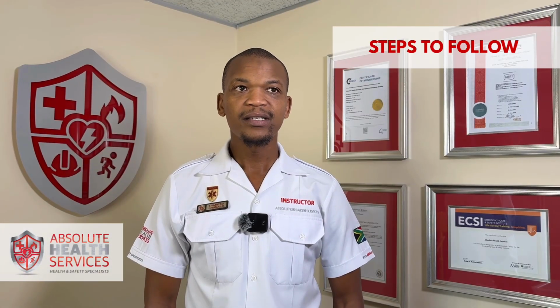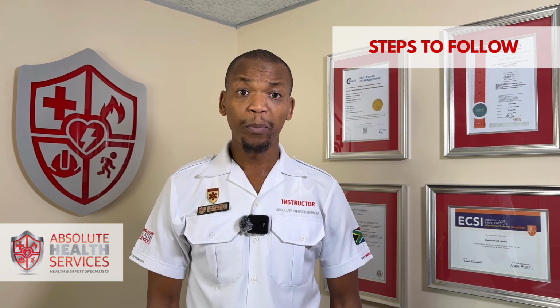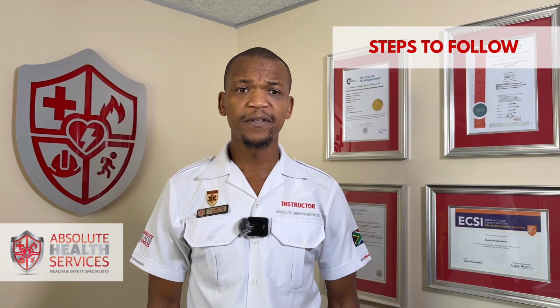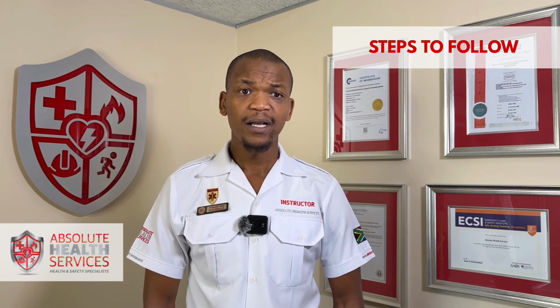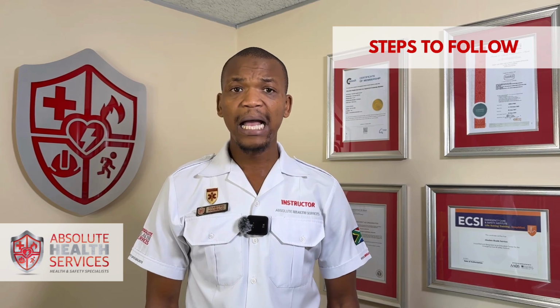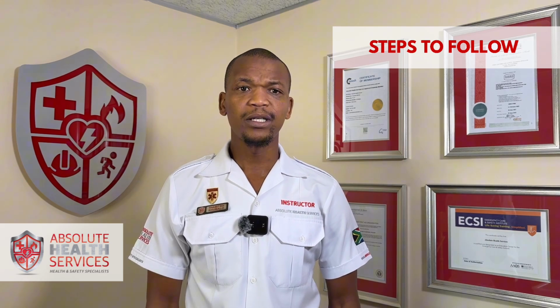So quickly, steps to follow. Arriving on the scene, make sure that the scene is safe, even inquiring from your bystanders what happened. Kneel down next to your patient. You check the responsiveness of your patient. If the patient does not respond to tapping on the shoulders and speaking out loud enough, say, are you okay? Or ma'am, are you okay? No response, call out: somebody help. While you are waiting for help, you then go and check the pulse and the breathing for 5 seconds, no longer than 10.